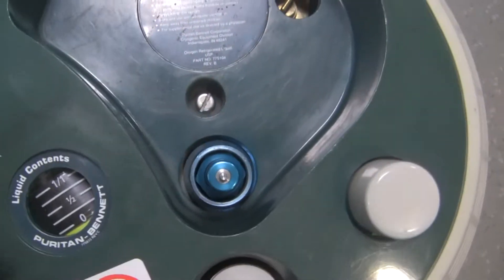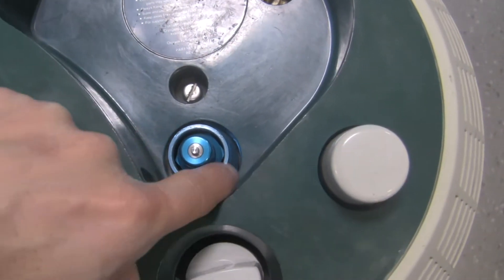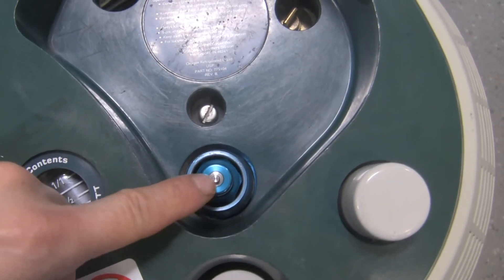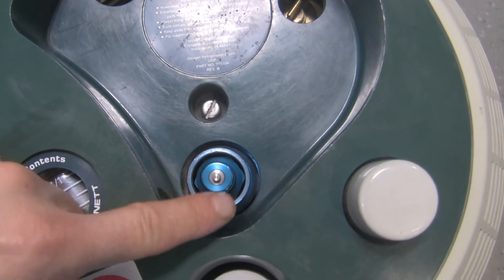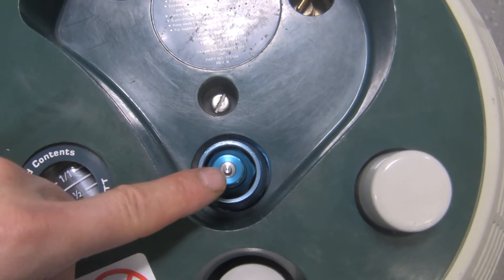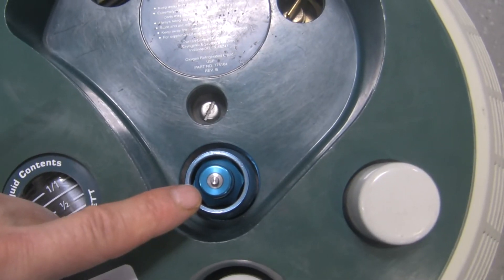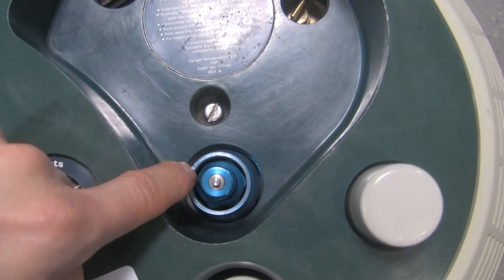If we go right to the top of the canister, you'll notice there's a ring and an adapter right here. This is the fill adapter — this is where the gas comes out of the liquid oxygen system. If this was frosted or wet, I wouldn't want to touch it because it could freeze my finger. So always make sure you've got the proper PPE on. Fill adapter, releasing ring.